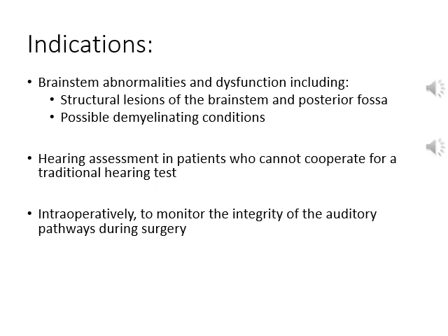Currently, as a standard of care, Toronto Public Health and the NICU test every newborn using an AABR, an automated auditory brainstem response. The AABR is similar to what we do in neurology, except that it is tested at 35 dB, which is a lower decibel level than the 70 or 90 dB that we typically use, and therefore the AABR is more able to detect mild hearing losses.